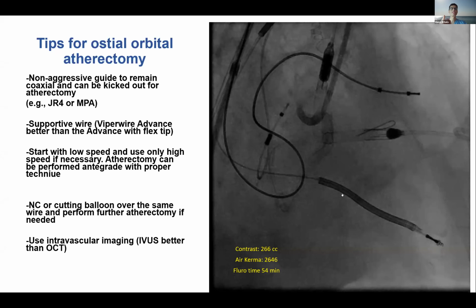But in my mind, at least for large perforations, I think the ping pong is still the way to go, because this way you minimize the bleeding into the pericardium and the risk of tamponade. I've had a couple of times where you perforate something, looks pretty bad, but then after 10, 15, 20 minutes of balloon occlusion, you take a brief puff and it looks much less, almost like a dissection, not really free flow out in the pericardium.